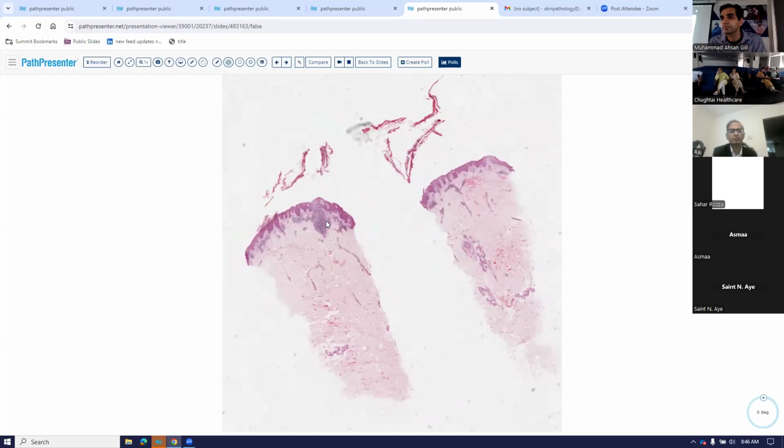But again, the clinical input is very important. This is mostly middle-aged to older patients, and they have very typical looking skin lesions of pemphigus foliaceus. And obviously immunofluorescence is going to be a big help, because the IgG and C3 pattern that you see in the epidermis on immunofluorescence can only be seen in pemphigus foliaceus, and it is not going to be seen in either bullous impetigo or staphylococcal scalded skin syndrome. So here again, the bulla is intraepidermal, subcorneal, where you can see the stratum corneum is sloughed off, but the immunofluorescence pattern will help make the diagnosis.